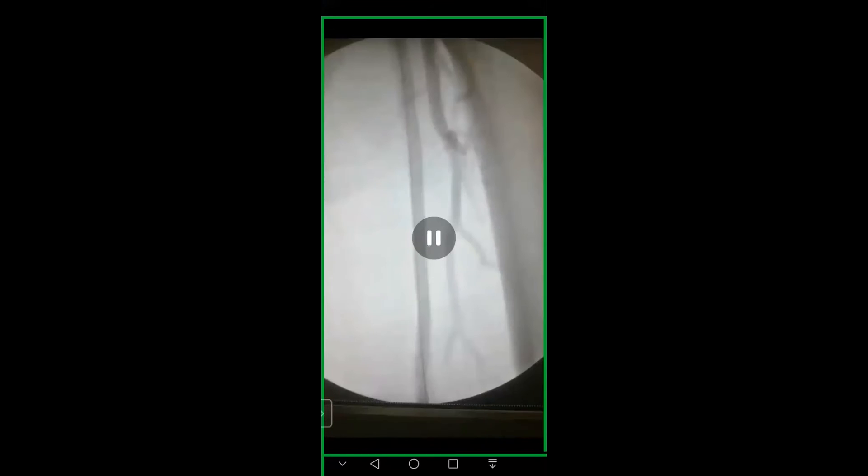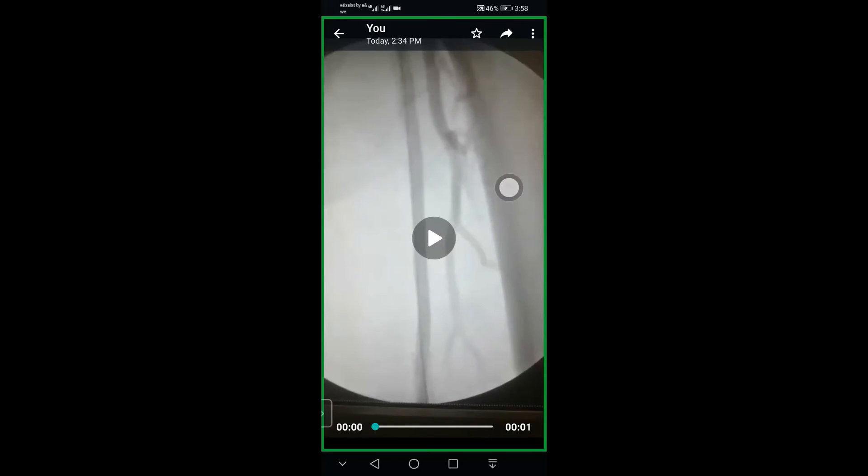After many trials with an additional supporting catheter, I was able to pass a 0.018 wire through the lesion in the distal part to P2. The wire can be seen passing through the anterior tibial artery. After that, for the uncovered mid-SFA segment, I placed a stent to bridge the gap between the distal and proximal stents.